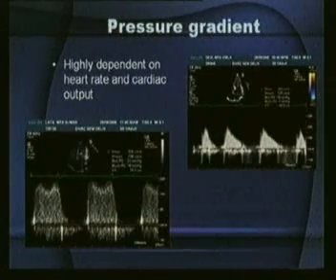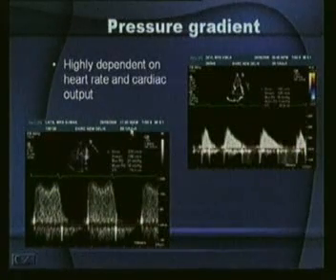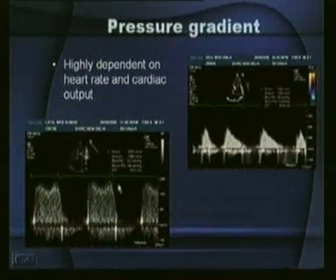Today nobody does it. It's not required. Why? Because echocardiography has taken over all this gamut, because within 10 minutes you can find out what's going on with the patient. So pressure gradient, this is of course dependent upon heart rate and cardiac output? Sure it is. But the idea here was to show you the difference between mild mitral stenosis and severe mitral stenosis.